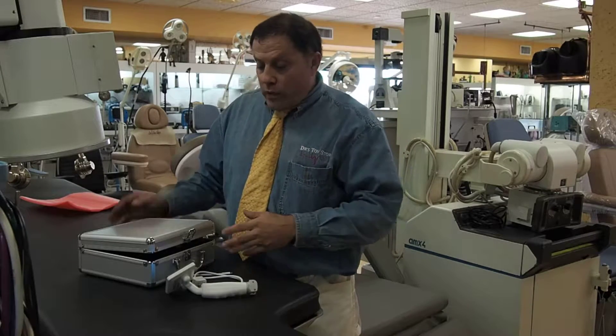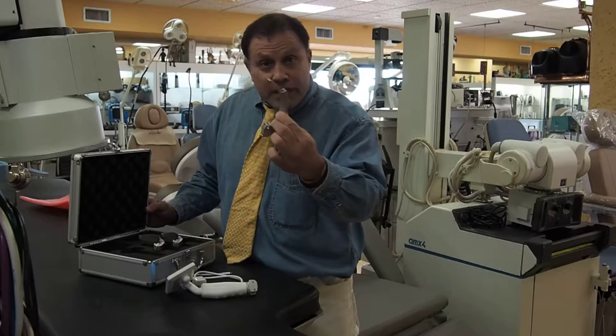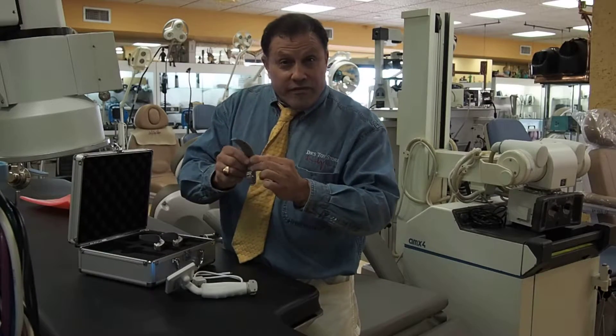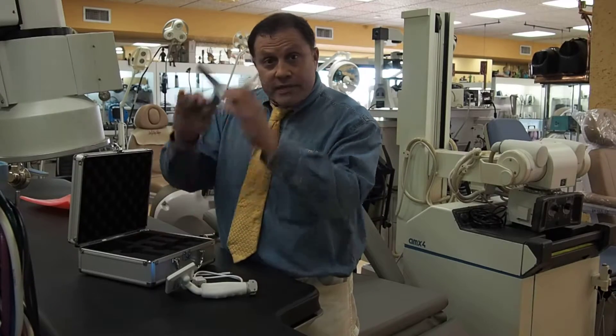GlideScope. Here at the doctor's toy store we've got a really nice one. It's got reusable tips. If you use these for disposable, they're very expensive. We've got these for $22.50. It comes with three different sizes.